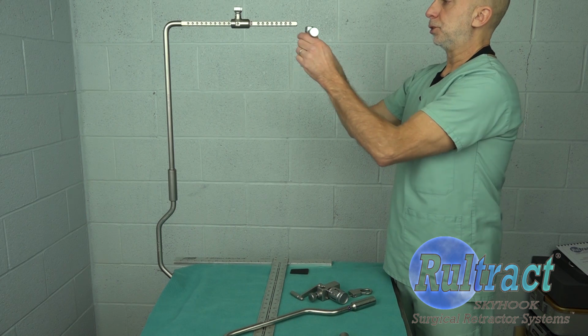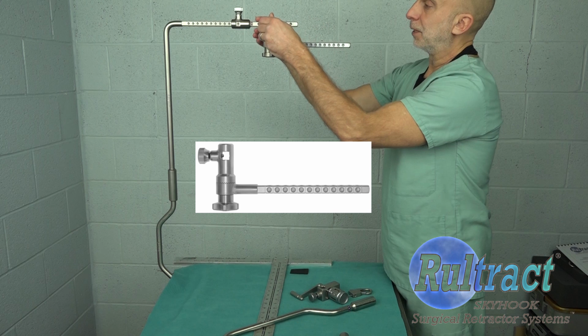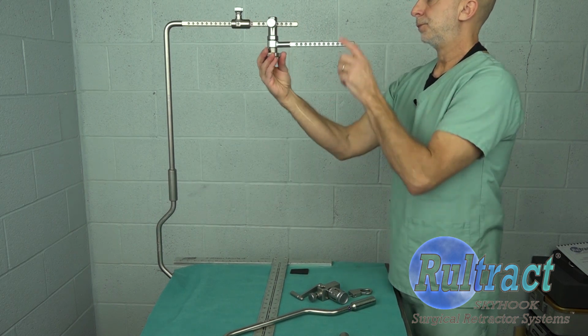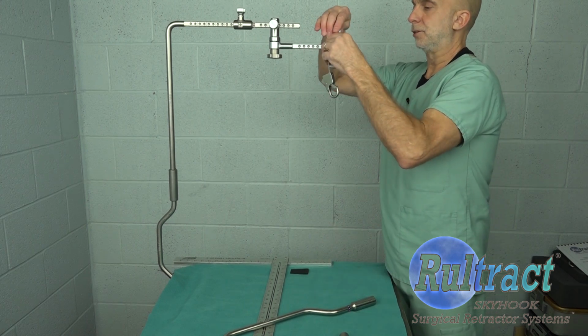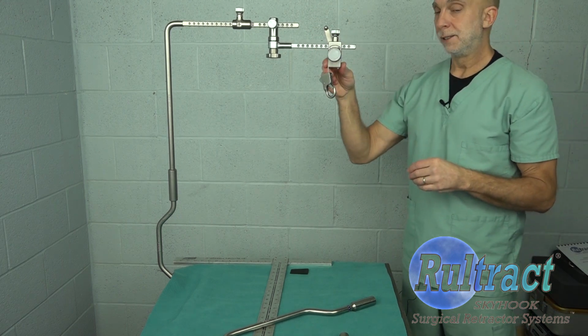I would say in most situations, again, you're going to want to put it on with this adjusting knob on the bottom and then lock it into place. So that is the setup of the Rultract retractor as used for the minimally invasive procedure with the Medtronic Thoratrak.